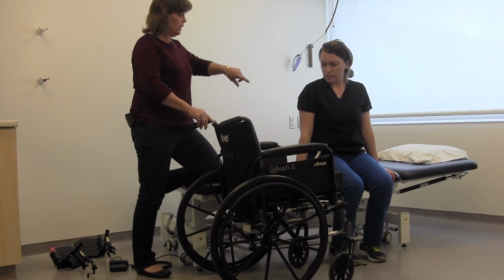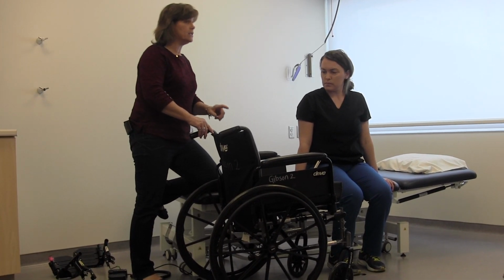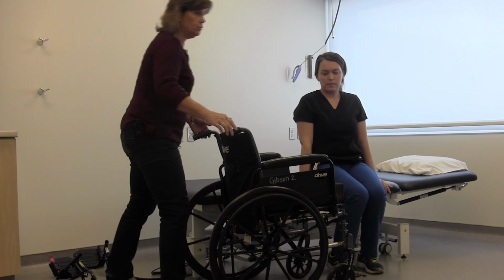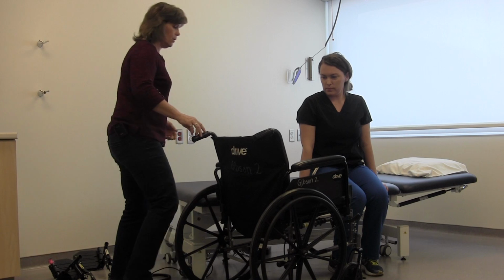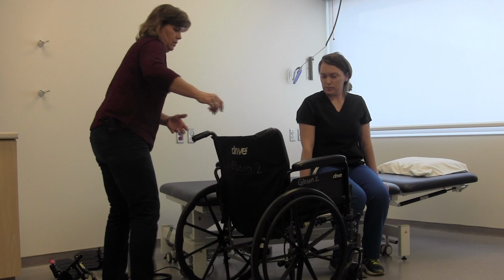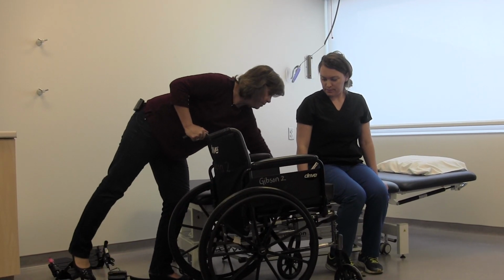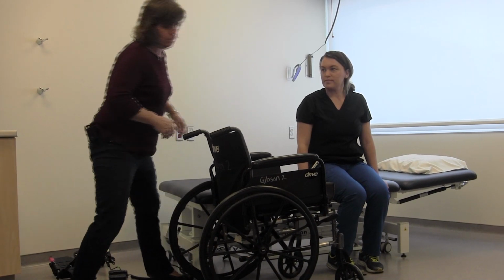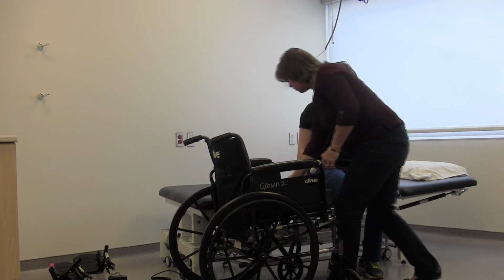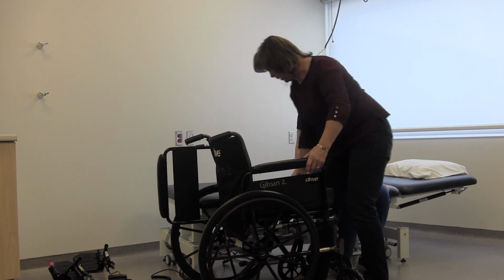So that Annette only has to swing herself 90 degrees, but we're not going to do the full 90 all at once anyways. The only time we would change that position is if we're using two people, and we put it more at an angle so that that second person can get in behind, okay? Otherwise, right at the bottom third or the top third of the bed. And if I can get the brakes on, that would be nice. There we go. And we're going to get the armrest out of the way.